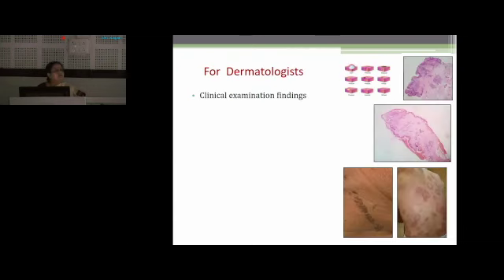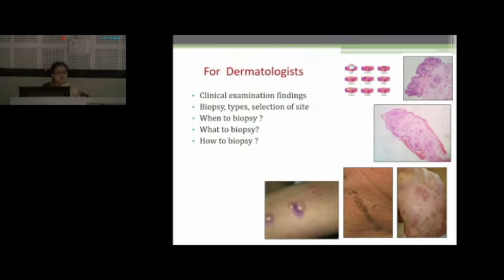All the relevant clinical examination findings, including distribution pattern of the lesion, whether it is single or multiple, generalized or focal, symmetrical or asymmetrical, with or without systemic involvement, and all other clinical details including age of the patient, must be informed along with the sample.